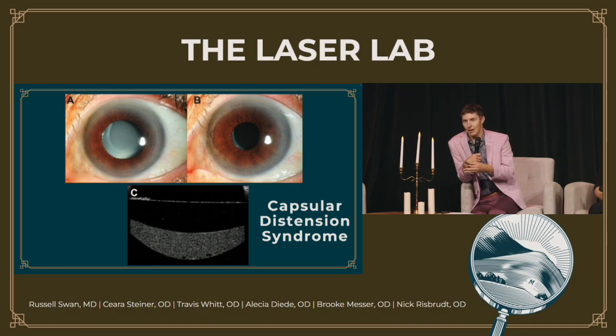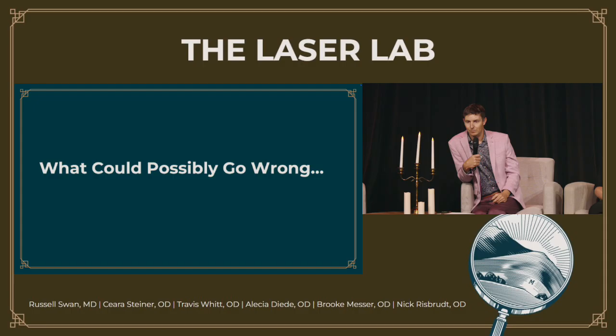They're almost universally, their anterior chamber is totally quiet. That's non-infectious, but their vision is super, super blurry. So with that case, how soon after cataract surgery was that? That one was like a week. And these are ones I would instantly YAG.